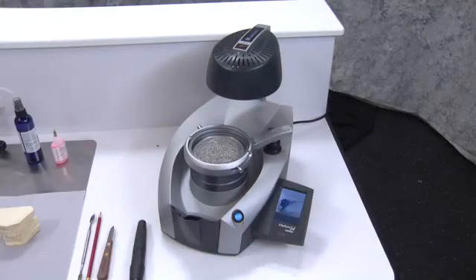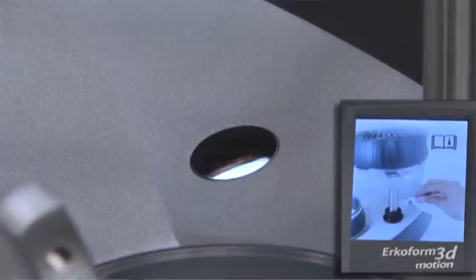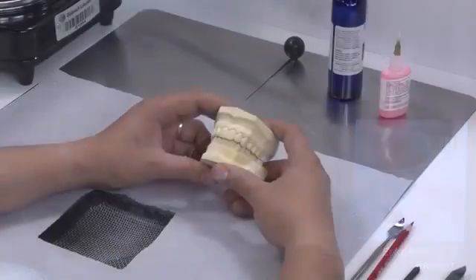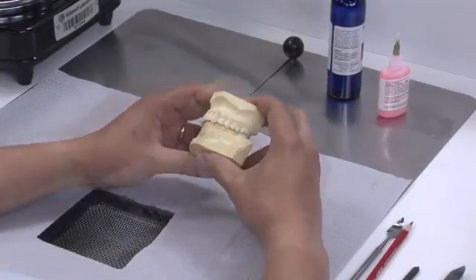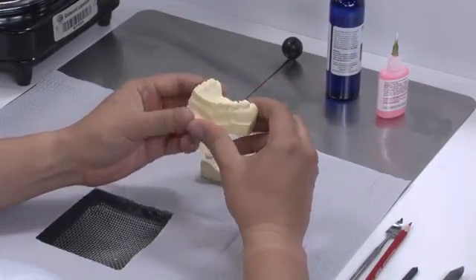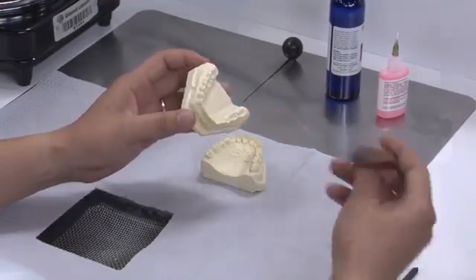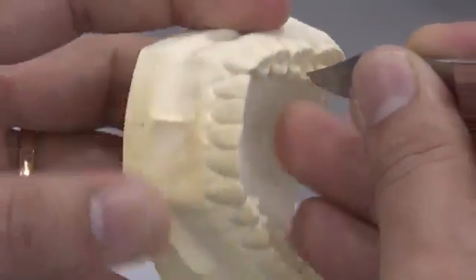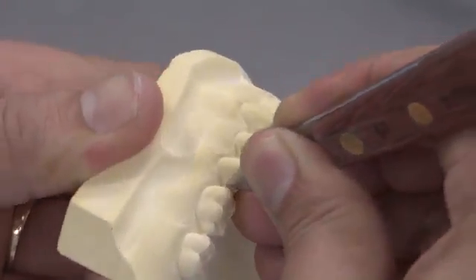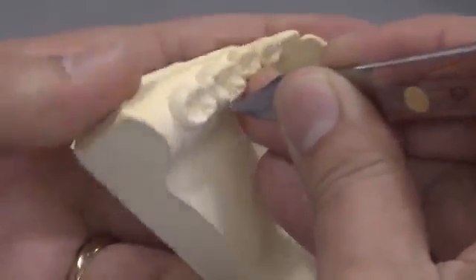To begin, turn the unit on. You'll be prompted to clean the heat sensor using a soft cloth. Wipe the heat sensor in a circular motion. Examine your duplicate models thoroughly. Look for any distortions or bubbles. Using a plaster knife, clean out any bubbles or inclusions that may have occurred during the duplication process.